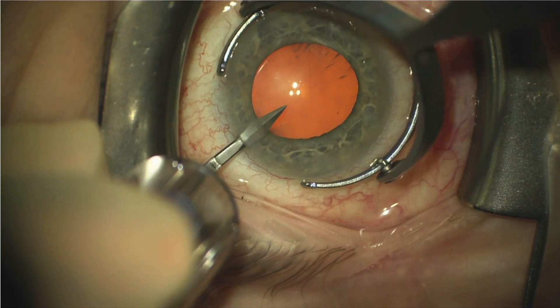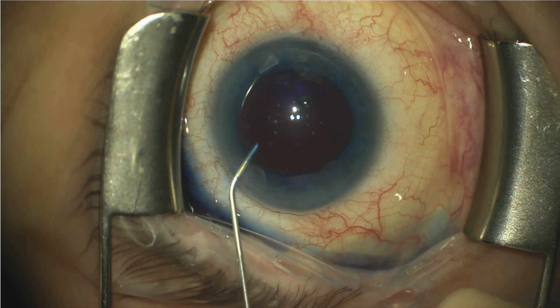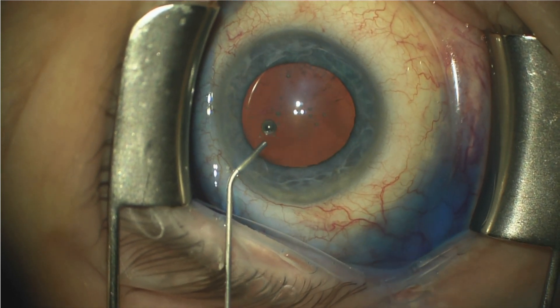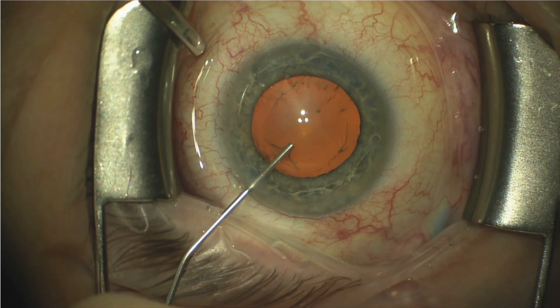We start off as usual by creating a paracentesis. We then use trypan blue, and the reason for this is that if we expect any issues with creation of the capsulorrhexis, it's good to have great visualization of the anterior capsule. The trypan blue is then removed from the anterior chamber, followed by injection of a dispersive viscoelastic.